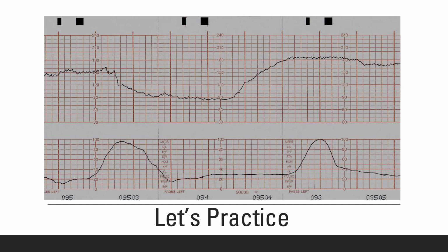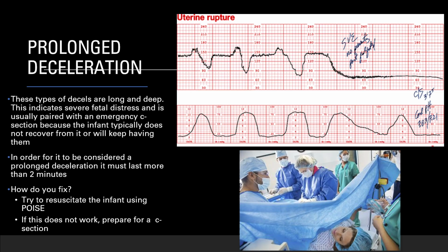This too is treated with POISE, making sure that you figure out what the cause is and intervene appropriately. And if the fetal heart rate doesn't return back to baseline, we may have to notify the provider, and then other measures will have to follow.